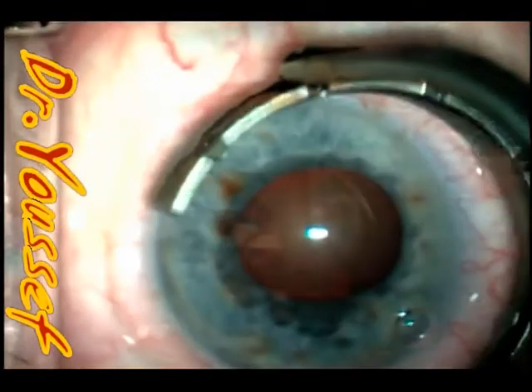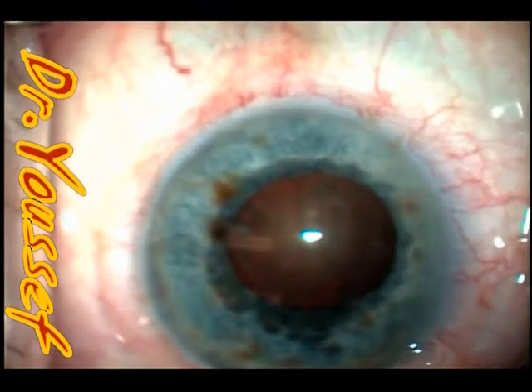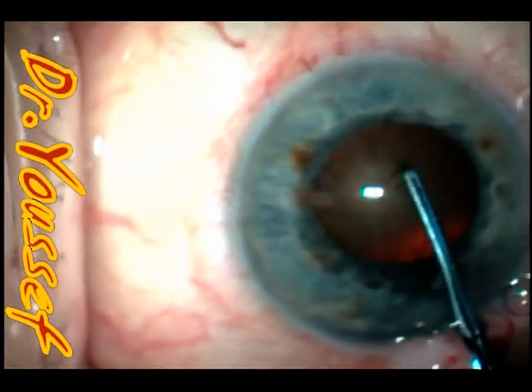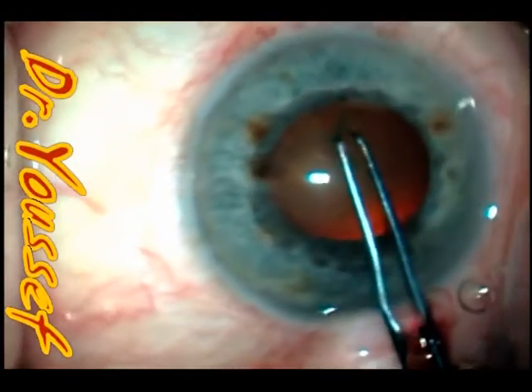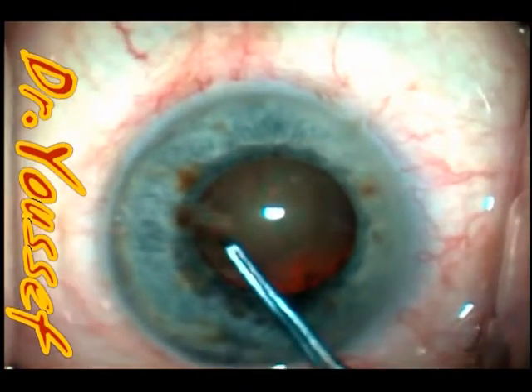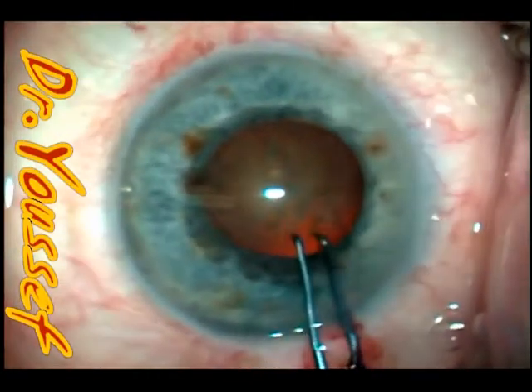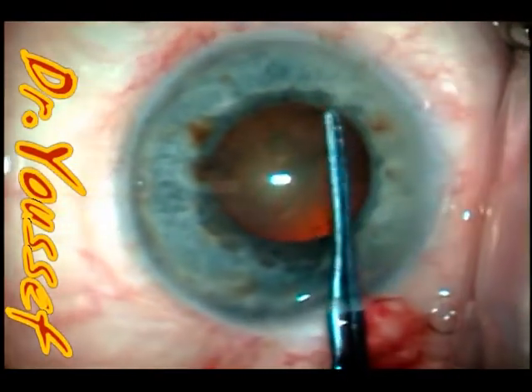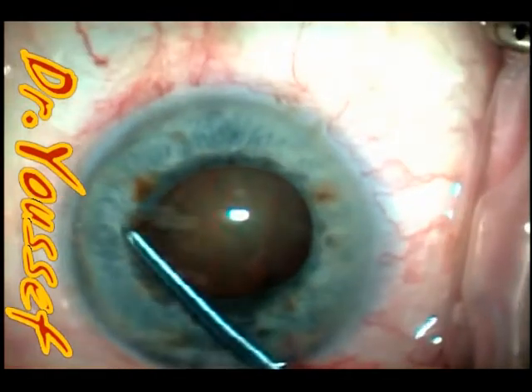The good thing about a small pupil due to scarring, like pseudoexfoliation syndrome, rather than IFAS — intraoperative floppy iris syndrome — is that this pupil is stable, so it stays the same size through the surgery and doesn't get smaller. IFAS patients can start with a much larger pupil and it gets smaller and smaller and unstable during the procedure, which is much more challenging. So for a patient with this pupil size due to Flomax, I'll implant the Malyugin pupil expansion ring or use flexible retractors, but for a patient with a stable pupil like pseudoexfoliation, I can do without it.